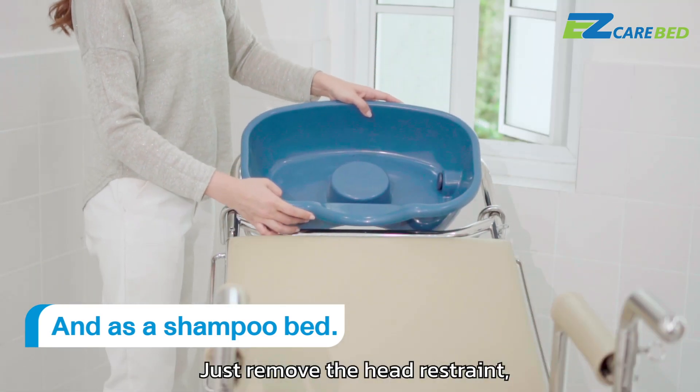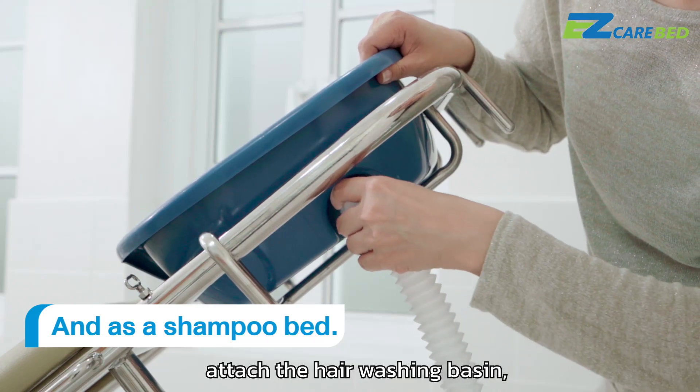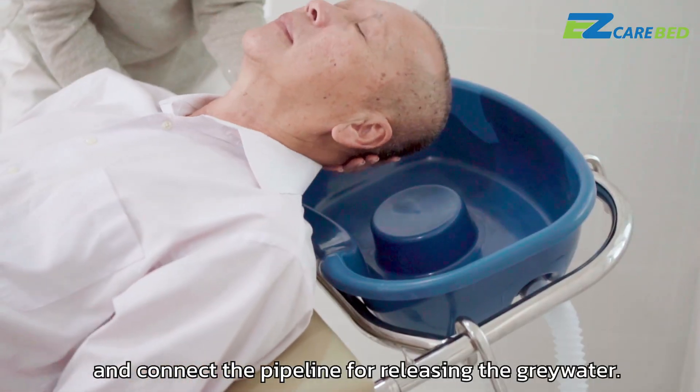Just remove the head restraint, attach the hair washing basin, and connect the pipeline for releasing the grey water.